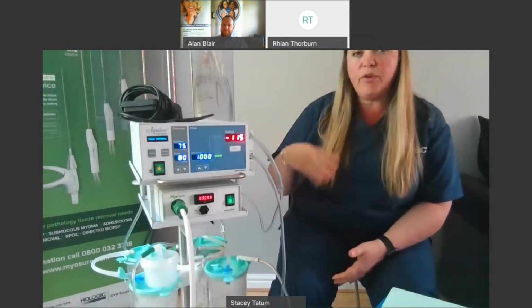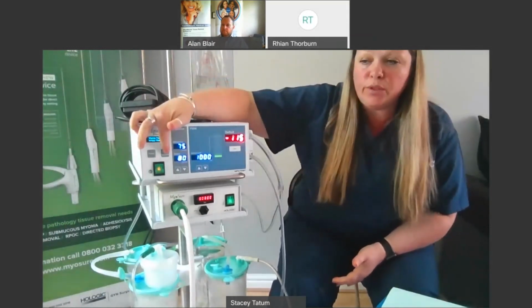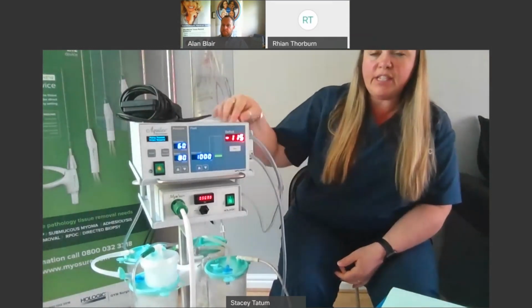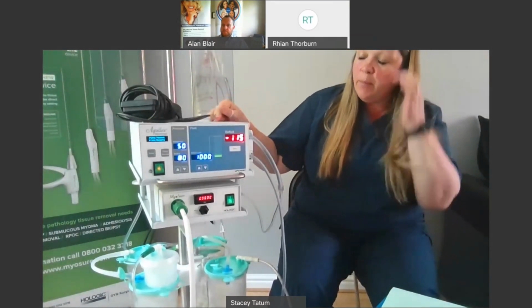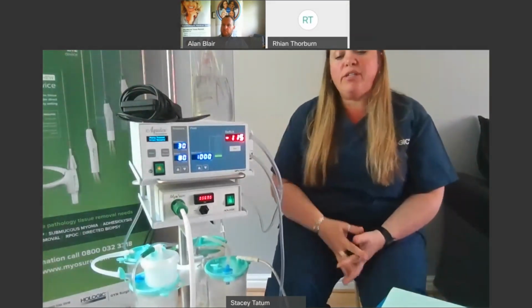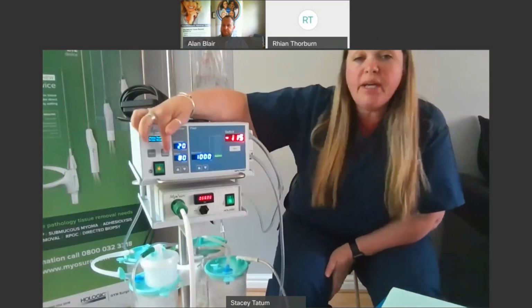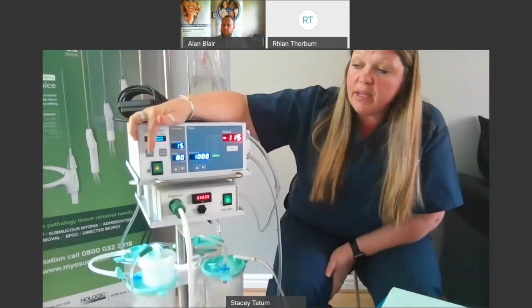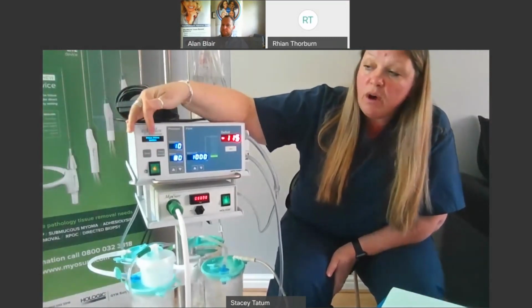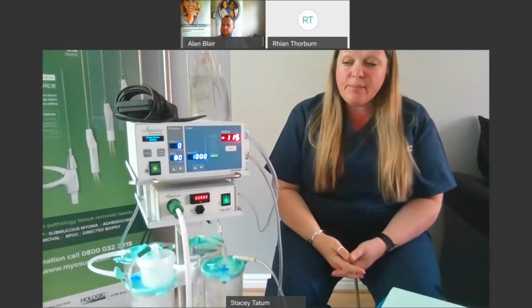So the first thing to do if you hear this is put the machine on pause. You would then take a reading of your fluid deficit, just jot that down. You would then spike your bag, and you would have to reprime the line because there'd be air in the line again. So to reprime, you would need to put it in pause mode, which it should already be in. Press and hold the prime key until the window asks you to prime again, and then you'd follow the steps of the first prime that you did.